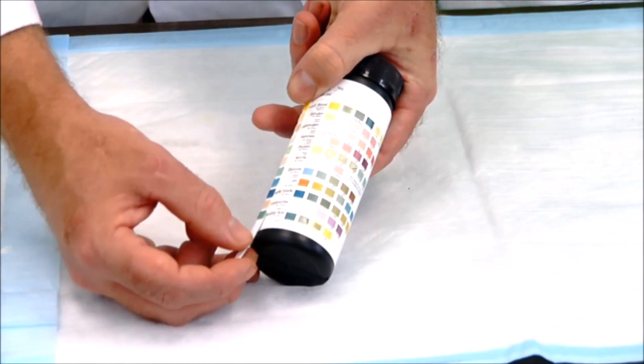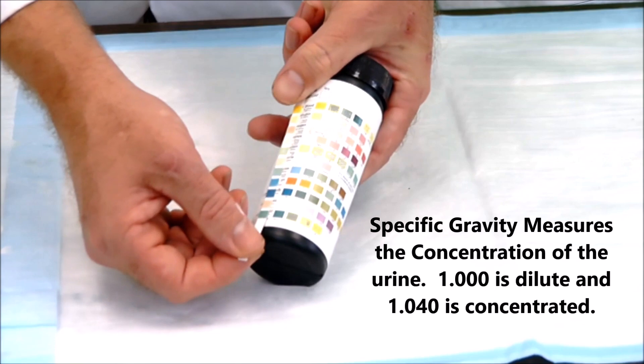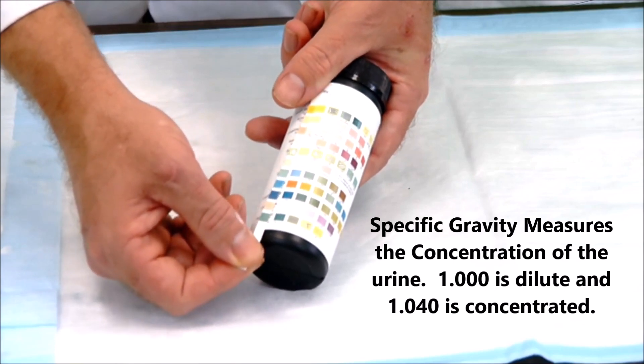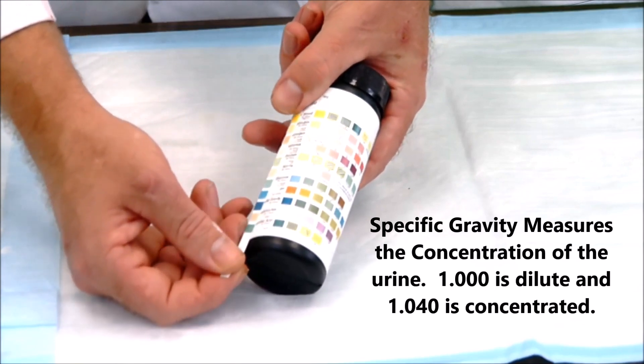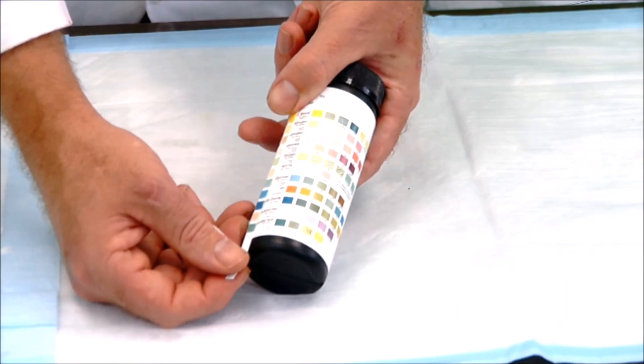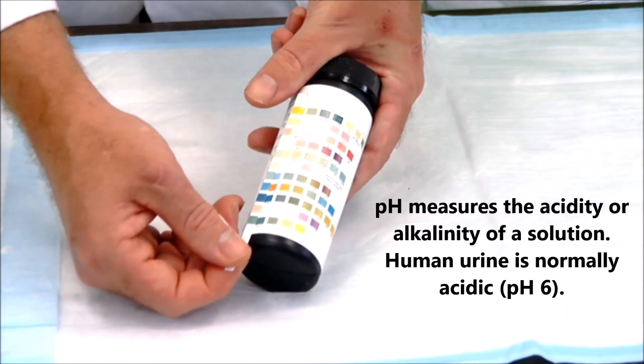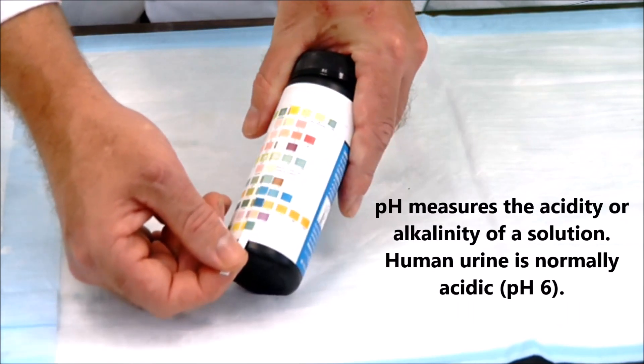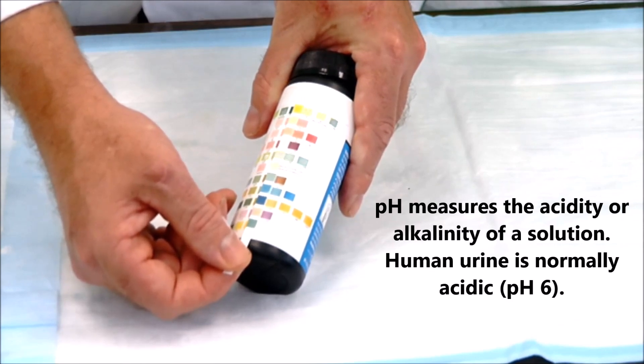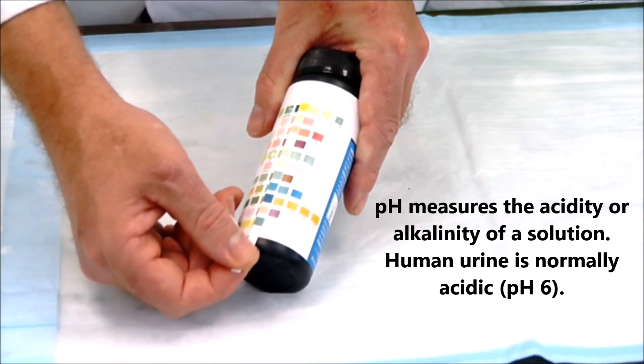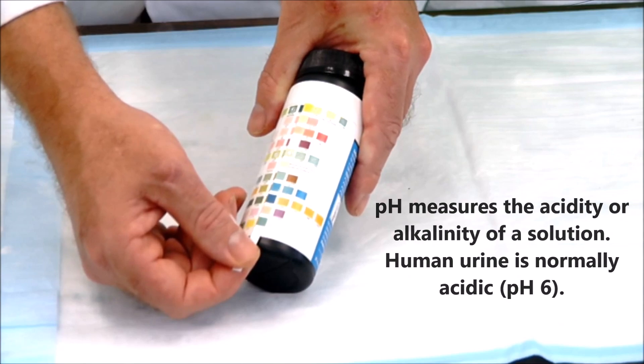Next is specific gravity. The specific gravity here matches up with 1.000, which is the same specific gravity as normal water. Now I'm going to look at the pH. Well, this pH thing goes all the way over to here. It seems like I have a pH of about 8, and that is alkaline, and that is unusual for urine. Normally, urine has a pH of around 6.